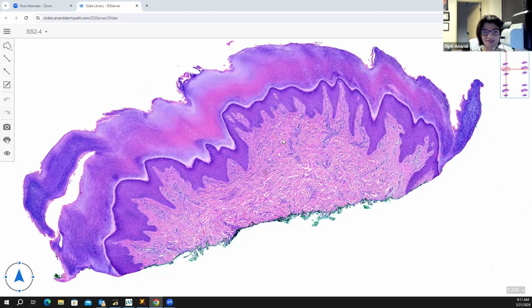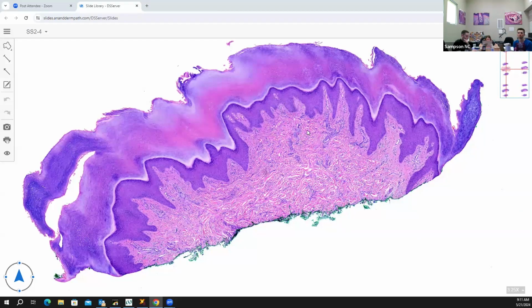So we're back. What do you think this is? All right, it looks like we're on a thick acral surface here, thick stratum corneum. You can see the stratum lucidum there. There's a little bit of superficial perivascular inflammation going on. I don't see a lot of edema, so I don't think it's pernio.